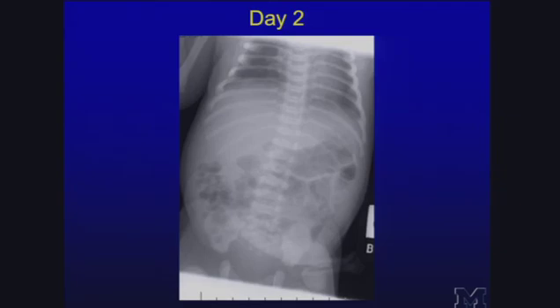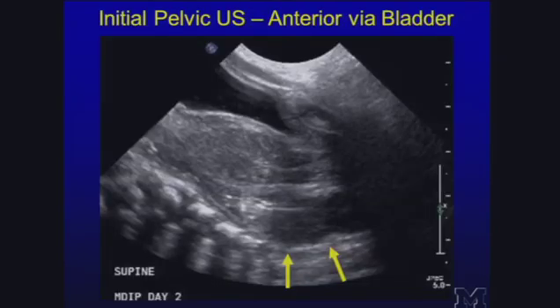Child is born. This is a radiograph, which is unremarkable. I do like to get radiographs. I like to see what's going on with the vertebra, if there's anything we're seeing that can be helpful. This was the usual, looking at kidneys and bladder, et cetera. There's the bladder. There's the very prominent but normal uterus that you see in a newborn girl from stimulation from the mother's hormones. And here's the low lumbar, the lumbosacral junction. This is the sacrum, and the area I'm showing you is really inferior to the coccyx, which is down here. There's this hypoechoic thing with some low-level echoes within it, and that's the thing that was seen in utero. Fine.